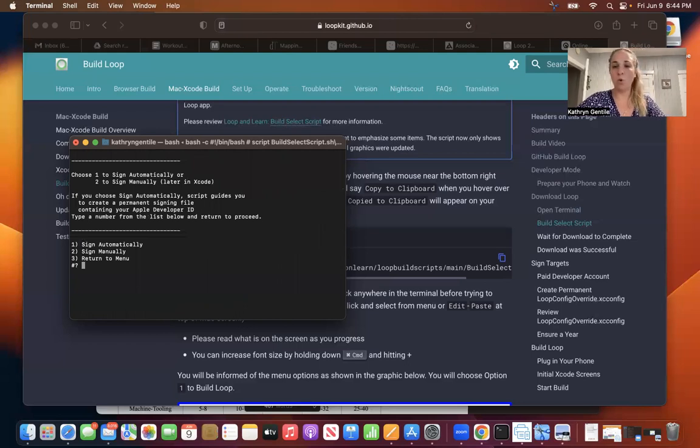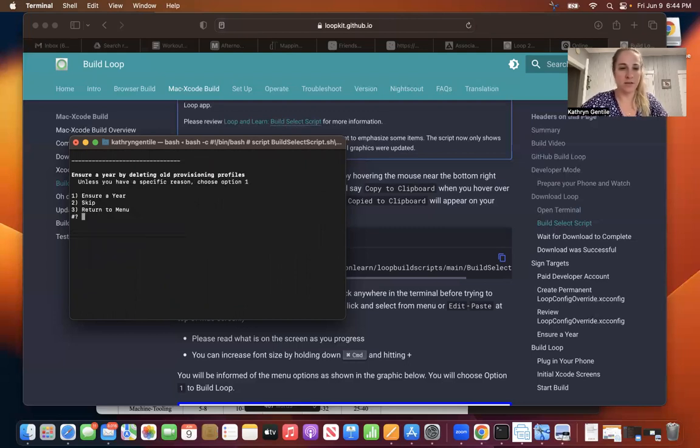So here you would type in one. You would want to sign automatically. It's going to make your life a lot easier. Not that it's too hard to sign manually, but that is what I'm going to be selecting. But you select one, and then it's going to ask for your team ID. You're going to put that in.